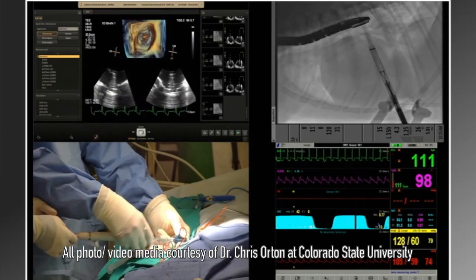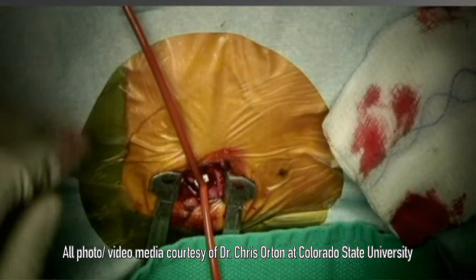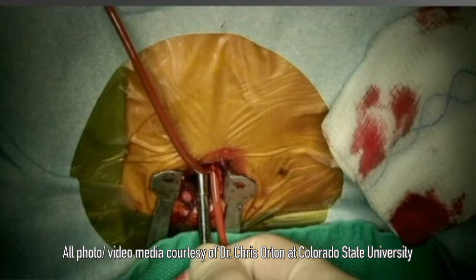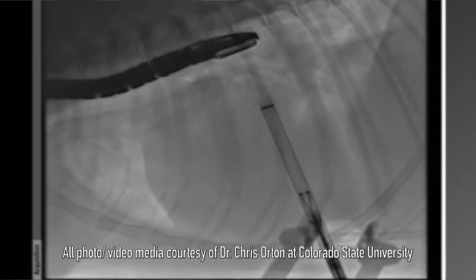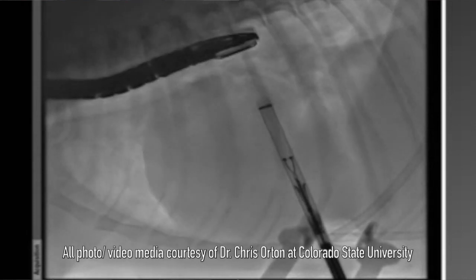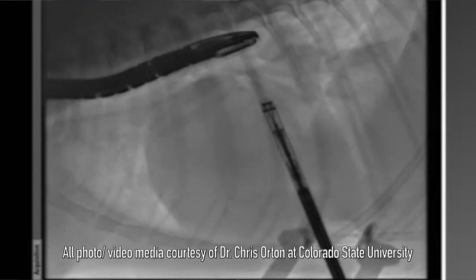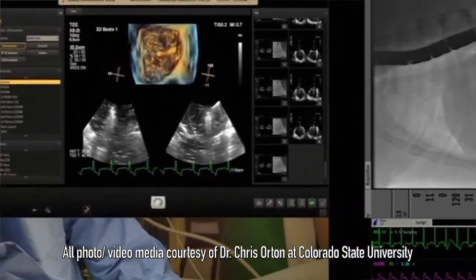The video collects everything that's going on in the operating room. In dogs, we access the bottom of the heart with a very small incision — about one inch — to expose the heart. We introduce the device through the bottom of the heart, and the heart continues to beat during the procedure. It is truly minimally invasive. The procedure is done under guidance of ultrasound or echocardiography.